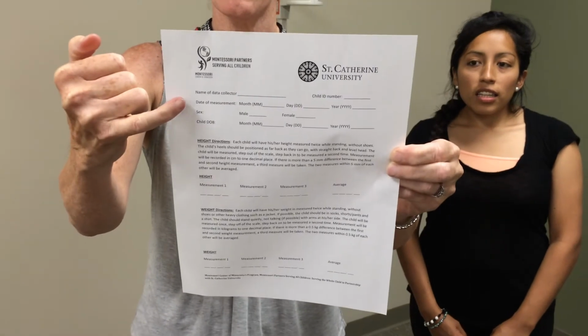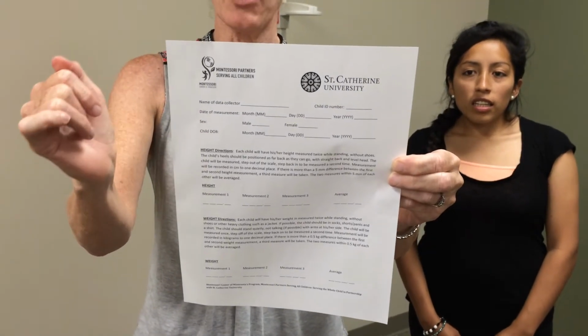I'm going to be giving you a brief training on how to measure heights and weights of preschool age children. The first thing I want to show you is you will be using this form. The top part of the form describes the child. There will be information already filled in, but I will need you to fill in your name and the date that you are measuring the child.